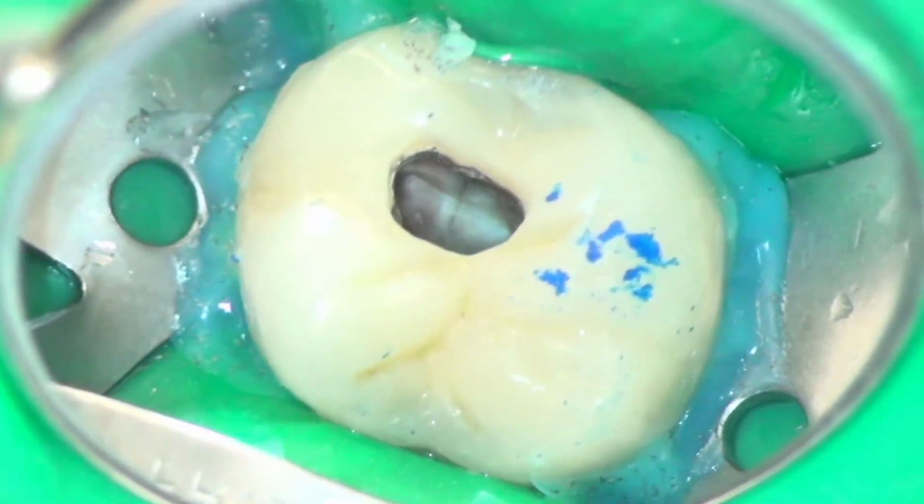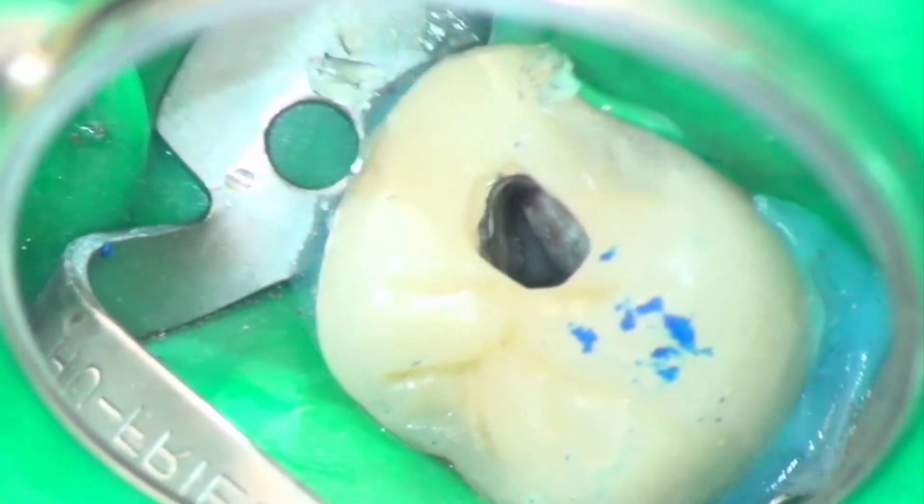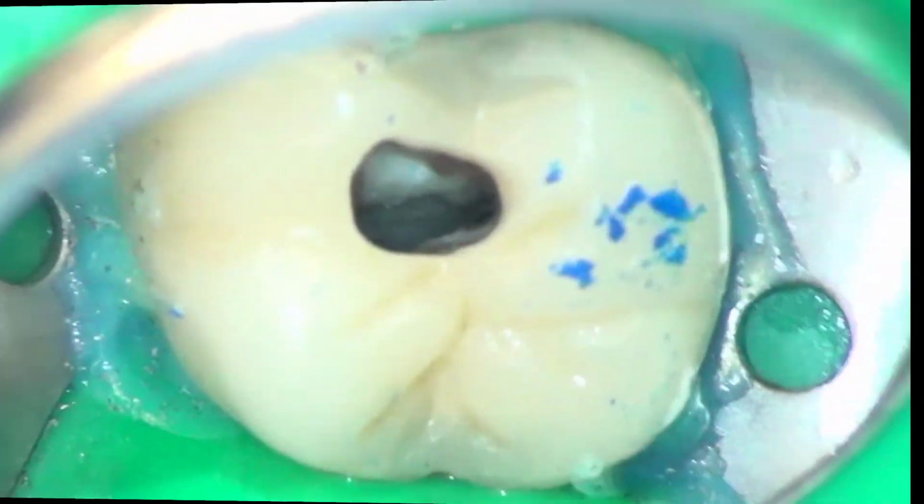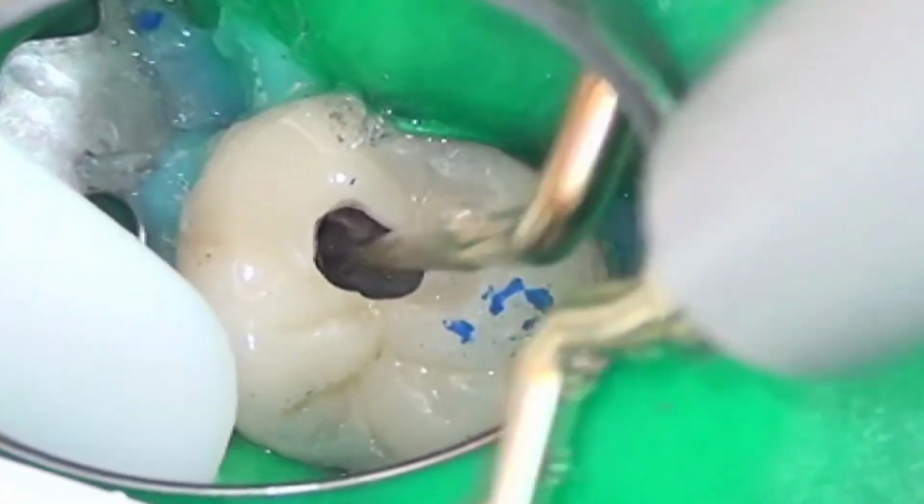Following the initial access through the porcelain crown and with the aid of a dental operating microscope, a fracture can be visualized on the mesial axial wall.